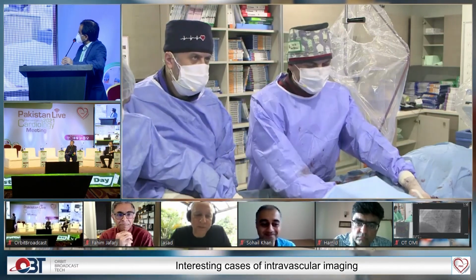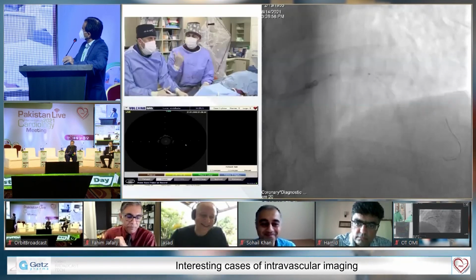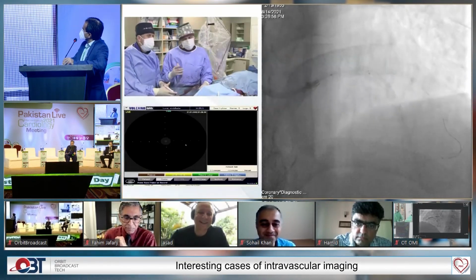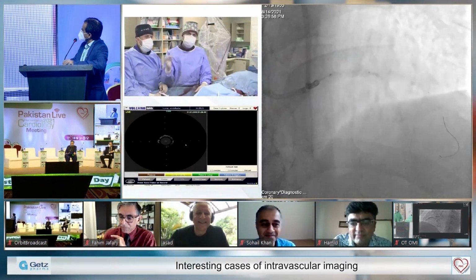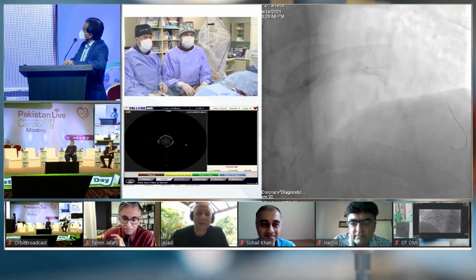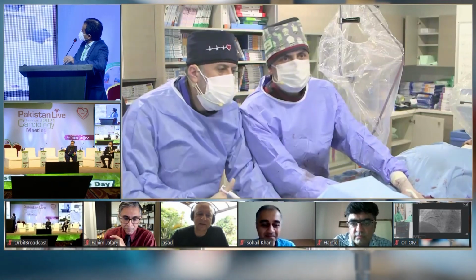Omar, you also pulled back the RG3, which you shouldn't do. True, that's true. But I told them, Ahmed Shakir, he heard that, but he blamed someone. But that's also important. We shouldn't lose the tip of the retrograde wire. Otherwise we lose. Well done, Omar. Thank you very much.